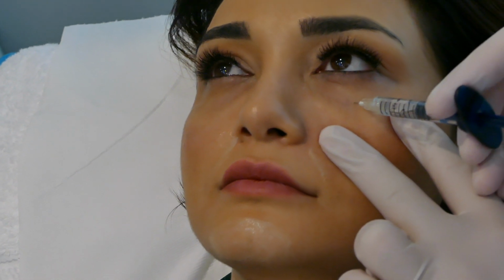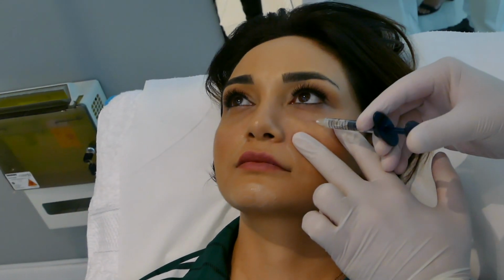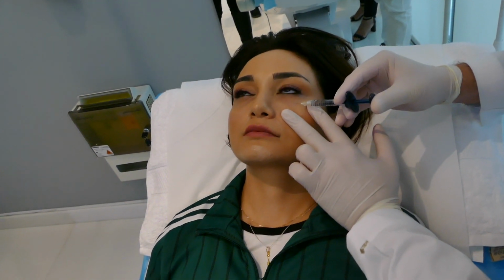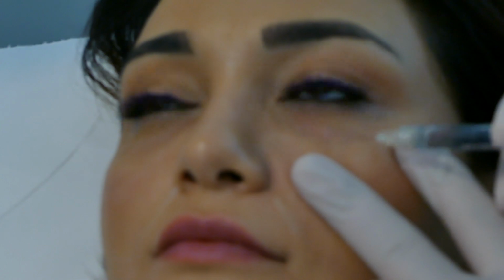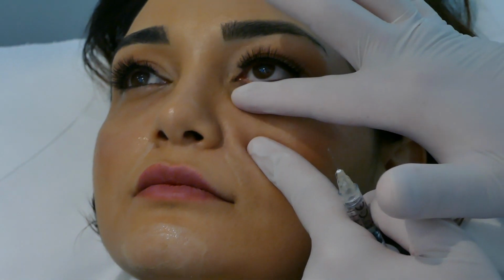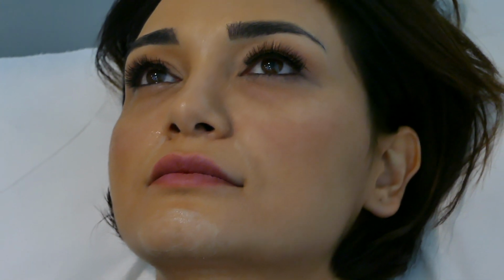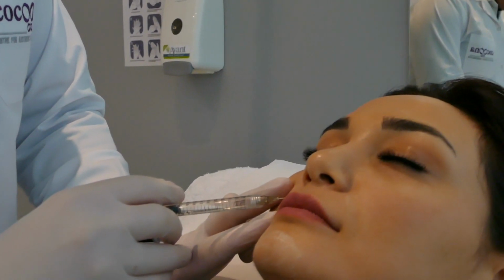So the key is to use magnification under the light to see for vessels, which is mainly in the medial part, and then do gentle injection with small aliquots to prevent problems. If the vein is big enough or the needle enters the artery, there will be a little blood that will pool into the hub of the needle, and if you see that, you stop injecting and you change the position of the needle. So again, coming back, very gentle placement, 0.01 ml at each aliquot, about 0.2 cc in the medial part and about 0.2 cc in the lateral part is good enough for correction of the tear trough.